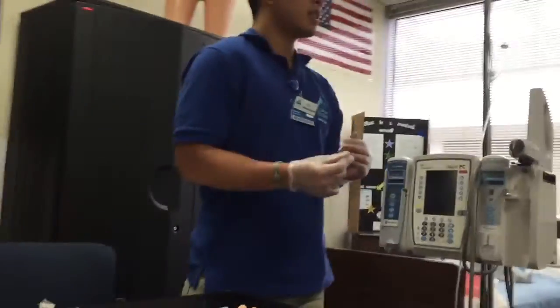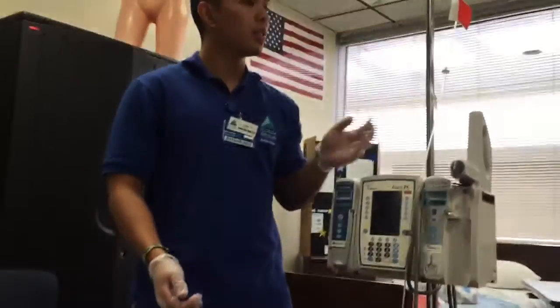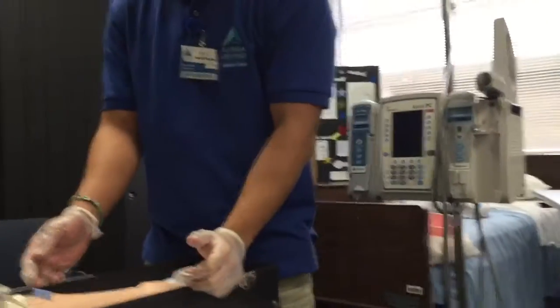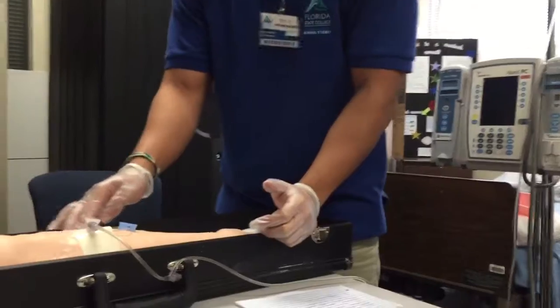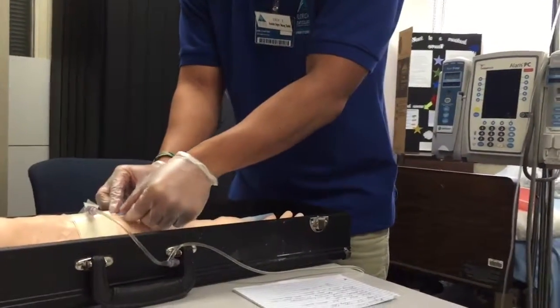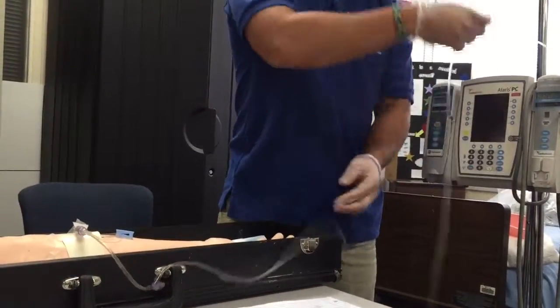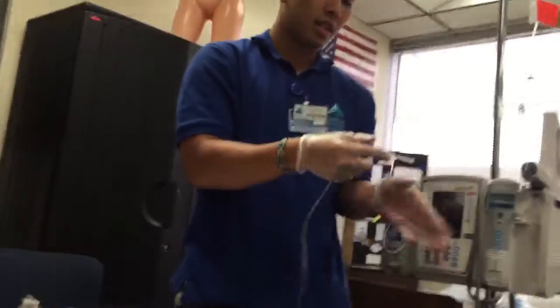have ran through. So we're going to go back into the room, inspect the bag to make sure that all the medication ran through, which it has, and then I'm going to inspect the site again. Inspect the site just to make sure that everything went through. There's no edema or anything around there, and all the medication is gone. So we're going to go ahead and clamp this off right there. Go ahead and clamp the mini bag off in case there is any little bit left, which there shouldn't be. You can clamp this off.